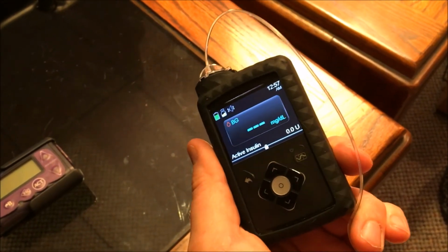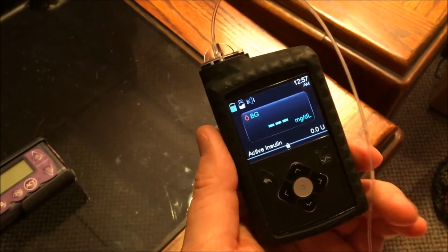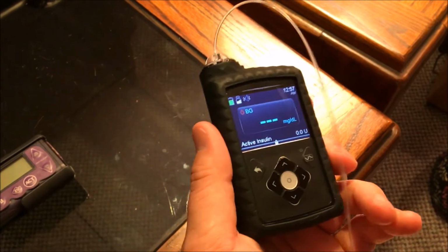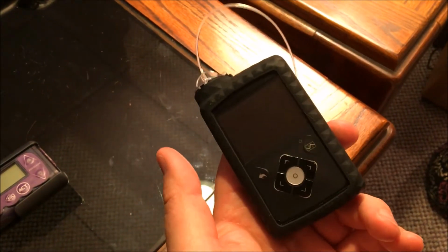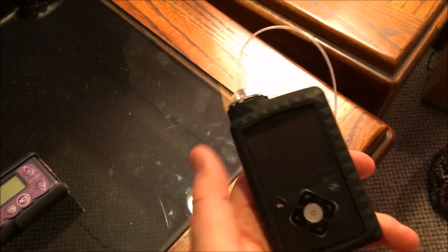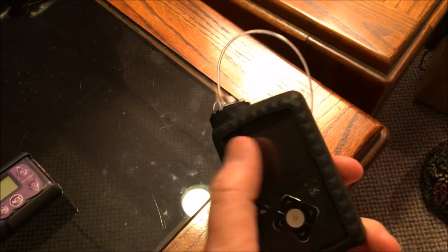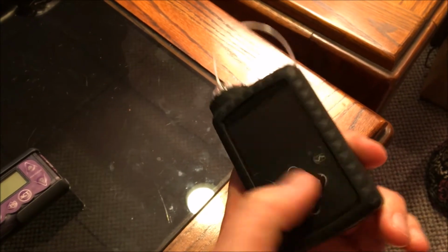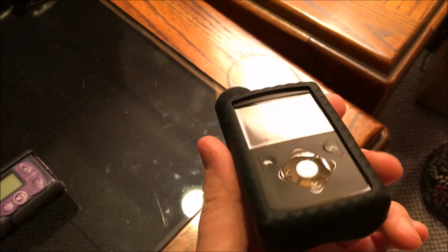Other cool things, obviously bolusing from the meter's cool. Again, that was something that was available on the Animas pump for years. That wasn't available on this. It does work fairly well. There's some complaints about it though. It does work fine if I manually bolus from the meter. If I try to sync with the pump, it gets my blood sugar results, but I could deliver insulin from the meter, but it tends to not calculate the boluses. It has an error, and I don't know why that is. Now my bolus wizard on this works great, so I don't know why it can't sync the bolus wizard. Maybe that's something I'm doing wrong and we'll figure out.